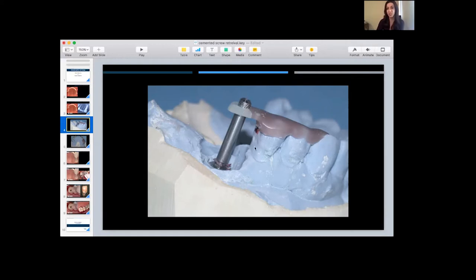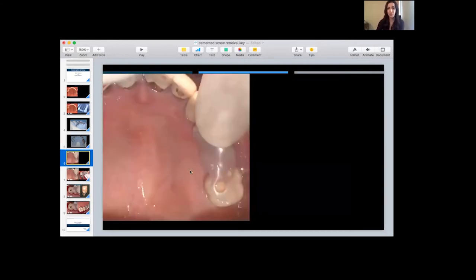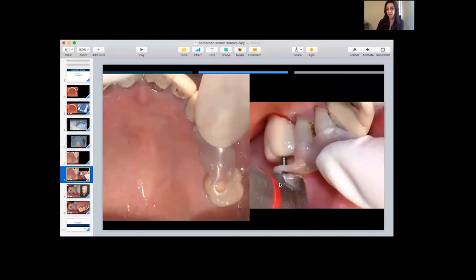Using the master cast, I took a guide pin, positioned it onto the implant, and had our lab fabricate a little jig that sits on the adjacent teeth and fits over the crown, indicating where the access channel for the implant abutment screw is. We can take this jig, try it in, and take an occlusal view to estimate where to drill through the crown to gain access to the screw. The access hole is more toward the mesial of the crown — not through the center or distal, but really in the mesial. The jig fits over the crown and directs the handpiece and burr. I used a diamond burr initially to cut through the porcelain and then a metal burr to go through the metal of the crown.